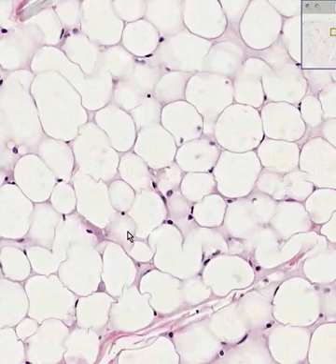And don't forget, you may have some collagen fibers here and there, and you may also have blood vessels like we see here. And we could definitely see some red cells within blood vessels here. Classical, boring, diagnostic, mature adult unilocular fat. Nothing else in the world looks like it, and it always looks like this.